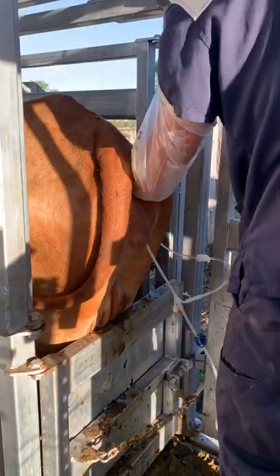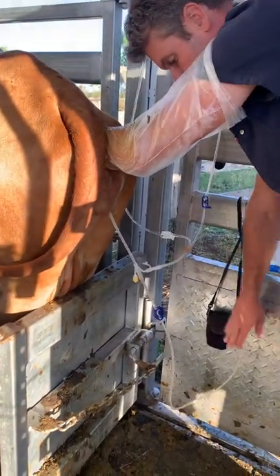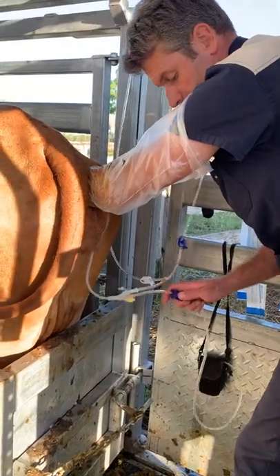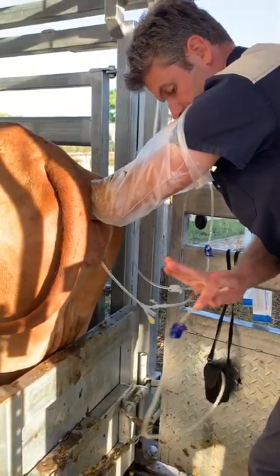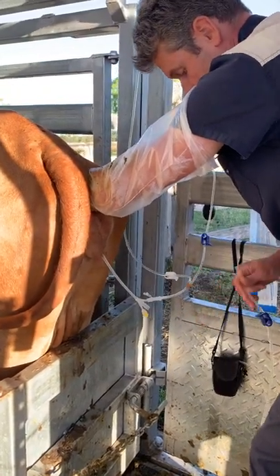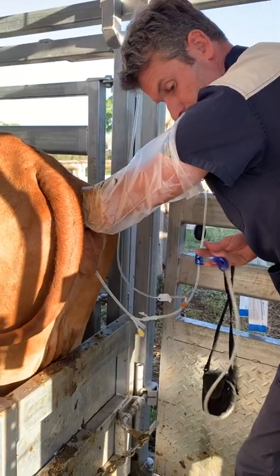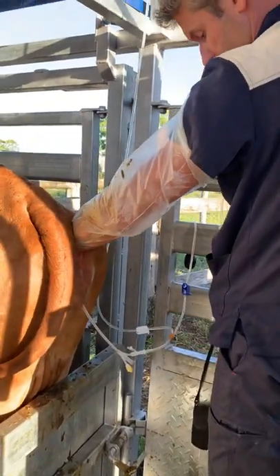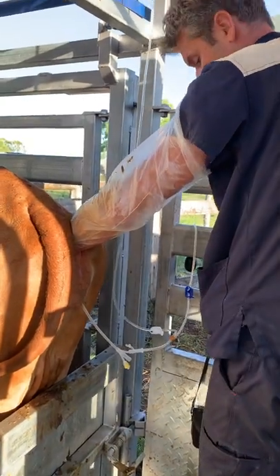And the embryos will be caught in the little petri dish? Yeah, caught in the filter down there. So I basically now will close this tube — the only way they can come out is via this tube, so that's closed off at the top here. Then I will put a red pin into it when I take this tube off, which will seal them in there. They'll be caught in that filter, and that goes to the microscope and then it will search.